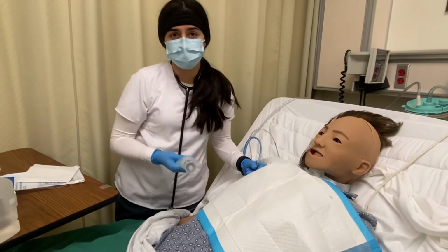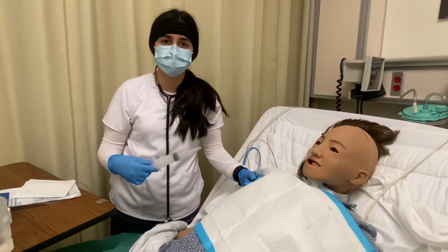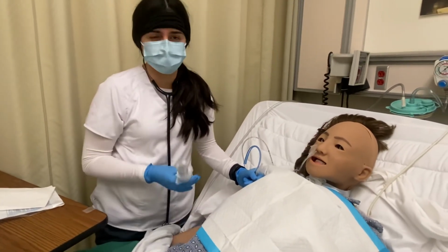And then depending on the hospital policy, some of them may ask you to aspirate, so that way you check for the gastric juices inside, so that way it's kind of an indication that you're in the right spot.